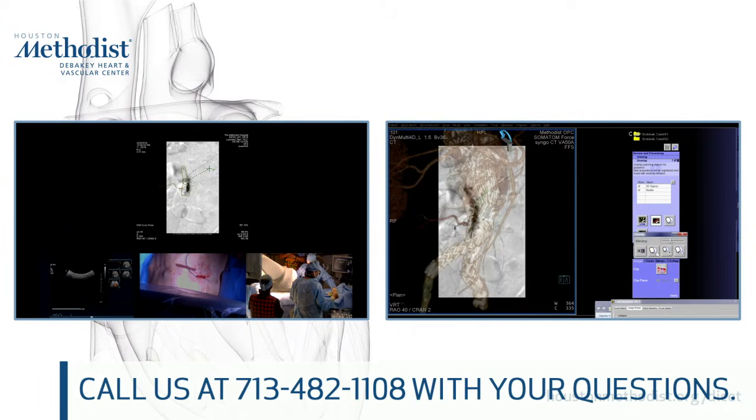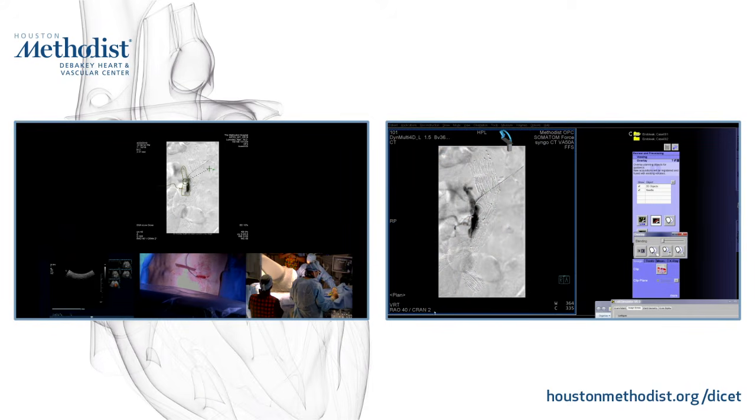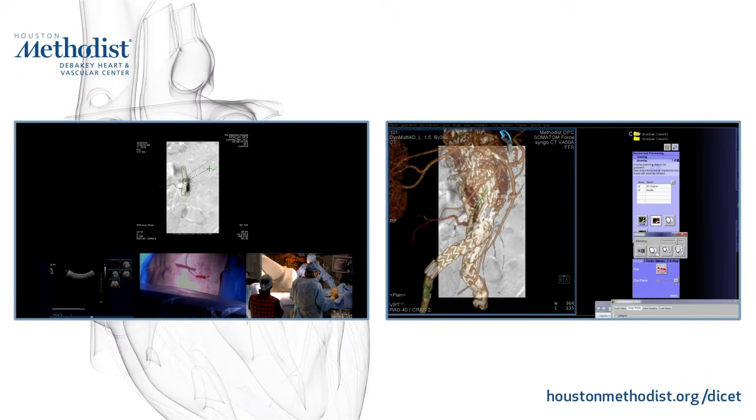So anytime you do an angiogram, the CT data set is intrinsically co-registered. So this is the 2D angiogram, and this is the 3D angiogram. As you notice, we also optimized our angle at RAO 40 and cranial 2 to be the best projection to see this lumbar artery. If we didn't have all this fusion, yes, we can do these procedures. I'm not saying no, but we would have to guess these angles either from preoperative CT or shoot angiograms at multiple angles.